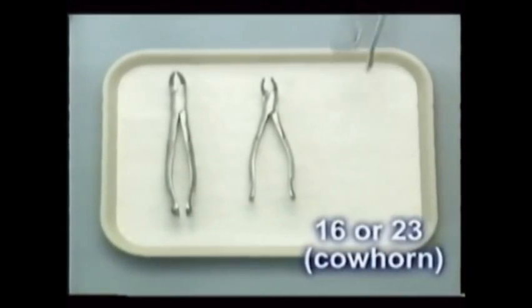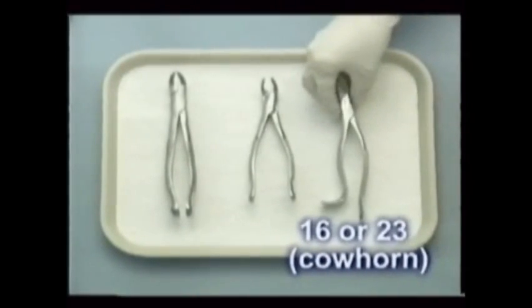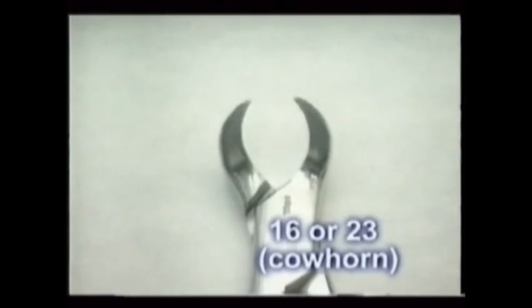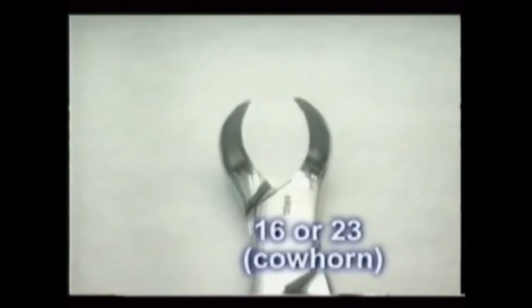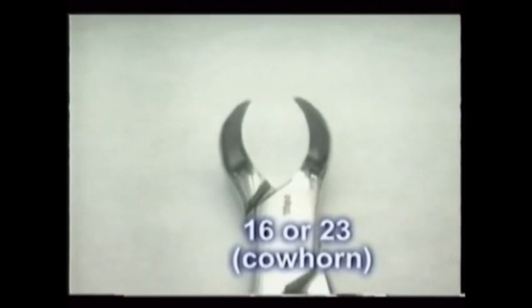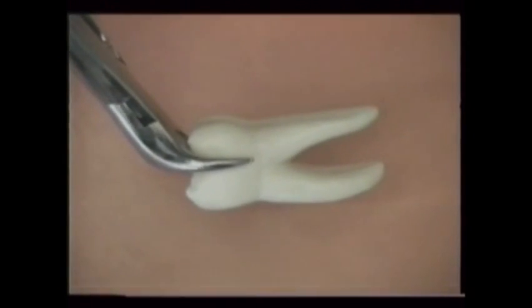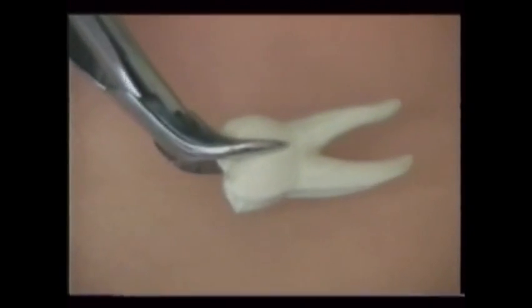the cowhorn extraction forceps, appropriately named, practically lifts the lower molars from their socket when its beaks are squeezed between their roots, and it can be used on either side. The doctor examines the extracted tooth, noting missing roots, root tips, or the presence of sharp bony projections.